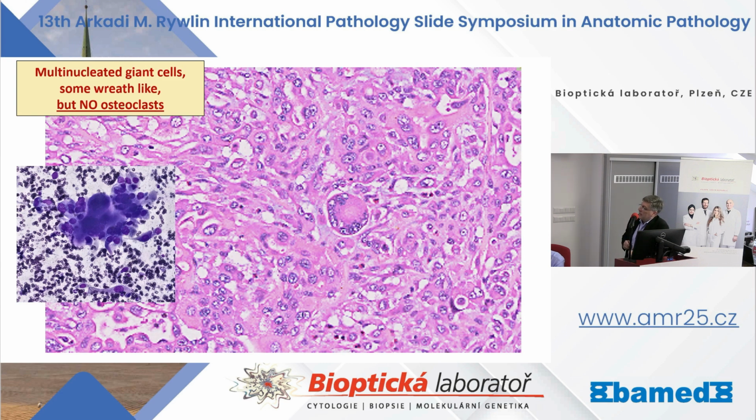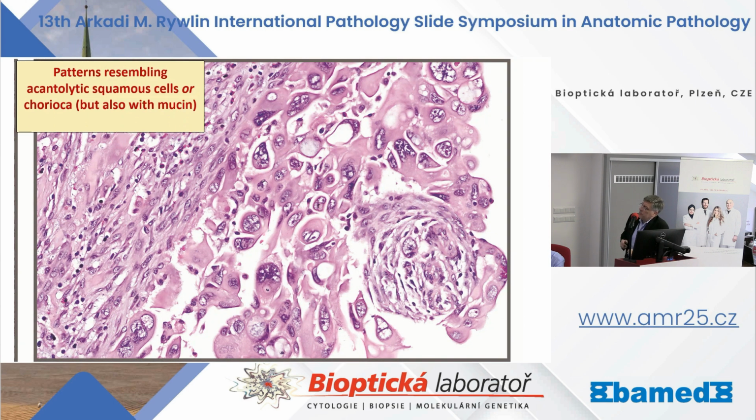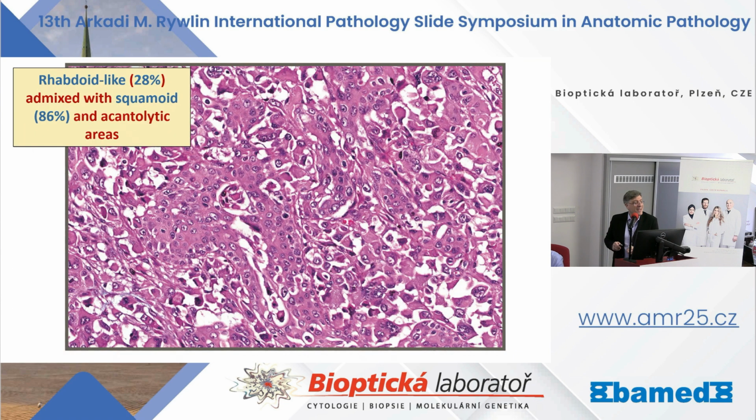high-grade carcinoma cells. Some examples have more rhabdoid appearance, and actually, to my eye, this also looked a little bit like choriocarcinoma in the sense that the cell nuclei are hugging the other cells, and their cytologic features, a little bit more squamoid, can remind you of choriocarcinomas. And if you do HCG, actually, some of these do show HCG positivity in the large cells. So there is probably some choriocarcinomatous differentiation in some of them.